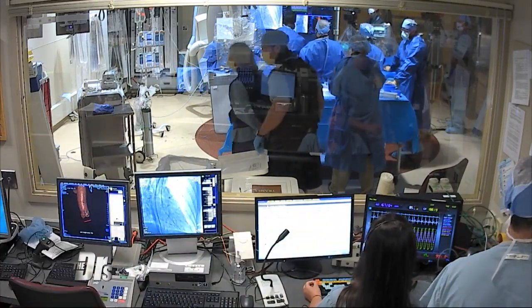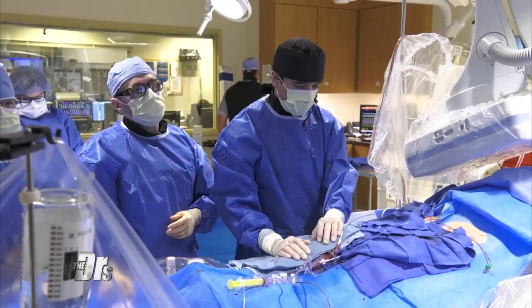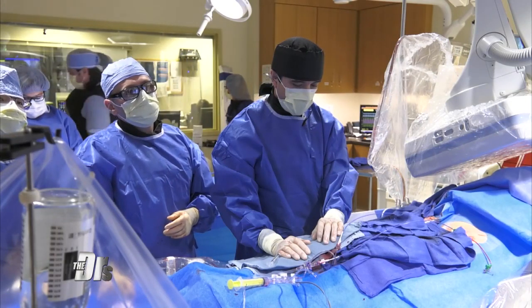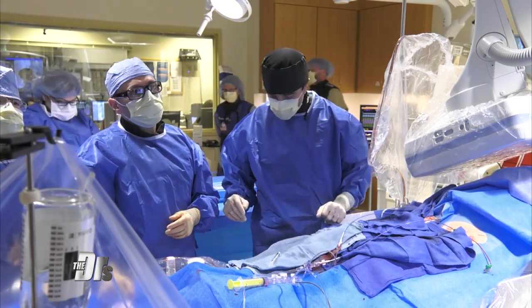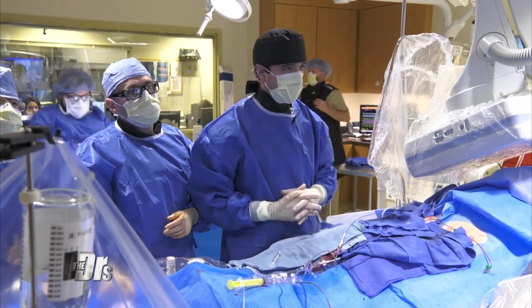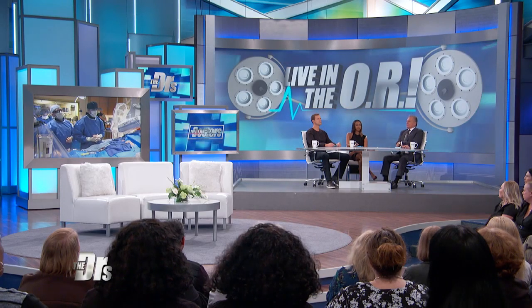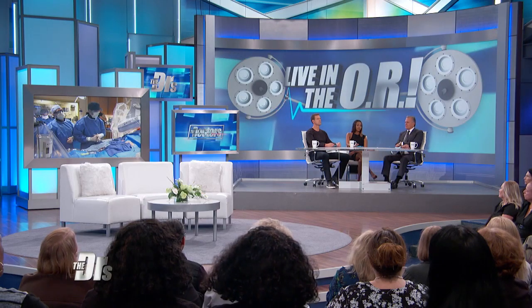We have equipoise there. And so when this technology was rolled out 6, 8 years ago or so, it was started in patients who were very sick, very high risk. And we looked at those patients and compared their outcomes with surgery and with this procedure. And this procedure was equally effective and beneficial because you didn't have the morbidity associated with surgery. Now we have studies that have shown that probably about another 20% of patients who have aortic valve disease, those with intermediate risk, are good candidates for this procedure as well.